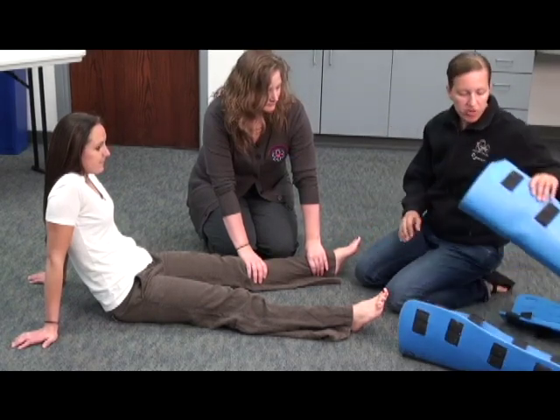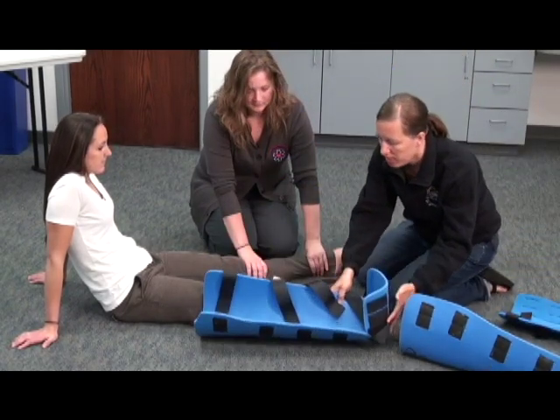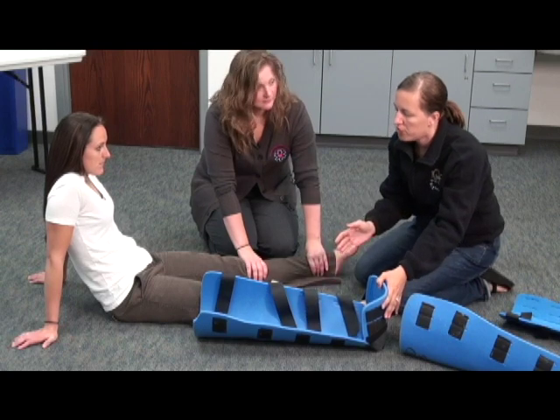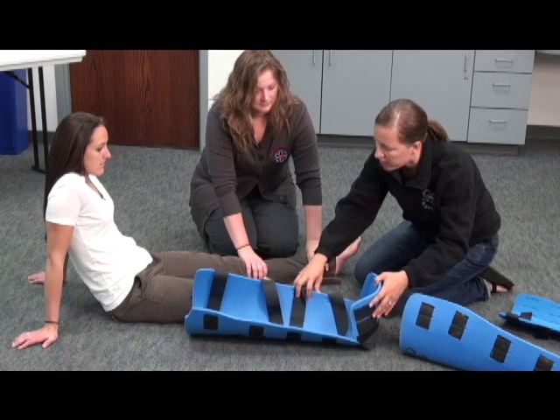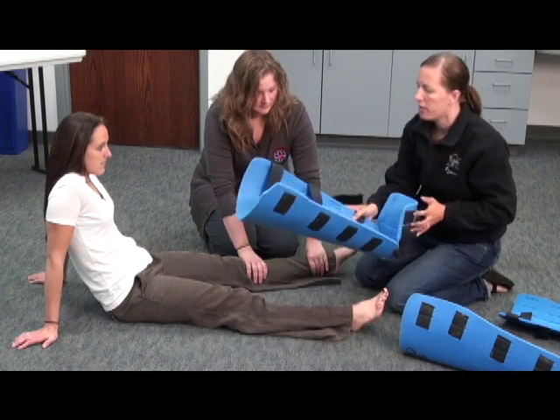At this time, I'm going to measure for a splint, making sure that the splint I choose immobilizes the joint above and the joint below the injury. This looks like it will immobilize the ankle and the knee, so this splint will work.